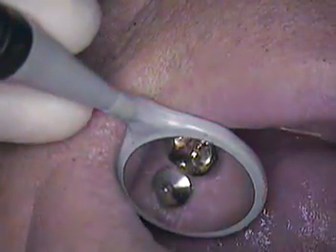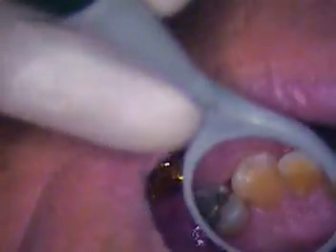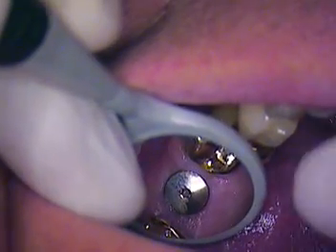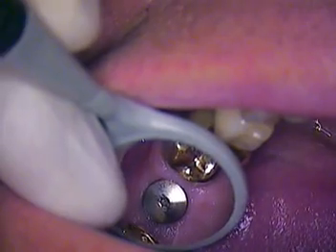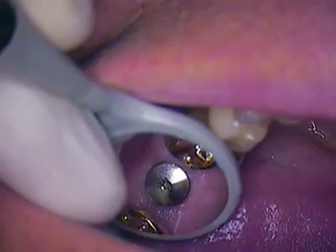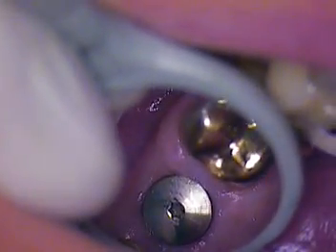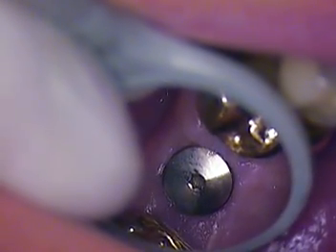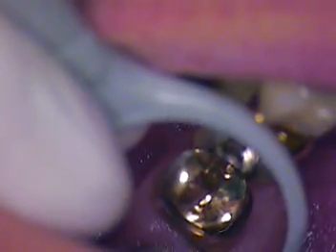Okay, so here we are. This is the top of the healing abutment. Nicely done. We see a beautiful gingival complex, but even before we remove the healing abutment, Explorer, please. We're going to check the path of insertion. With the microscope, we can actually do that at high power. Move it right on up to about 5 power here. And we can close one eye in the microscope and actually check the parallelism. Looks like we're perfect, so we really don't even need to touch anything.